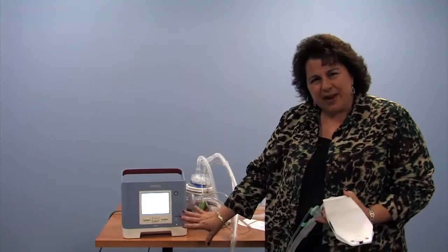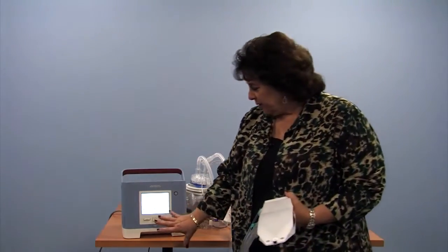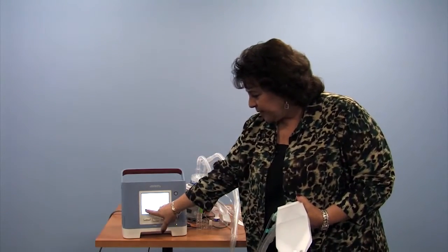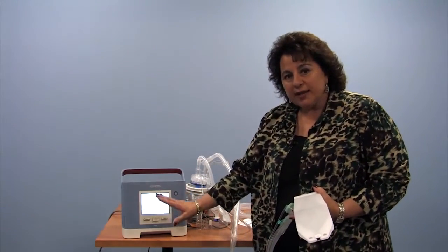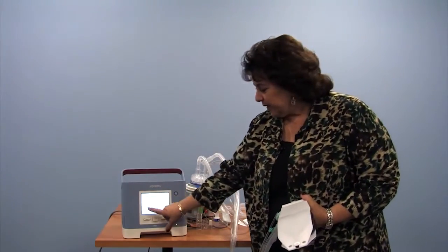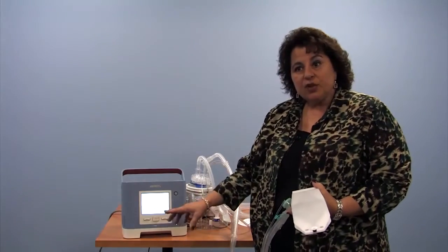Let's talk about the battery power a little bit more of this machine. You see some in this lower level. Well, we see a lock button there. That means we're on non-limited view, so anybody can go in and change anything right now. Typically, the machine will be locked so that you can see the settings, but you cannot change them.